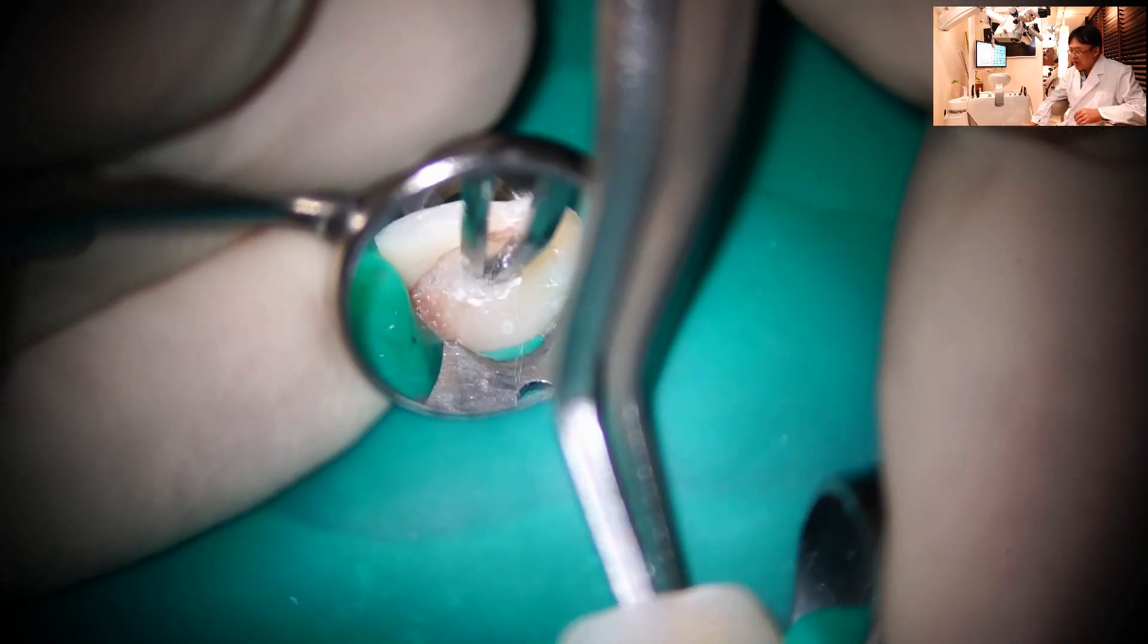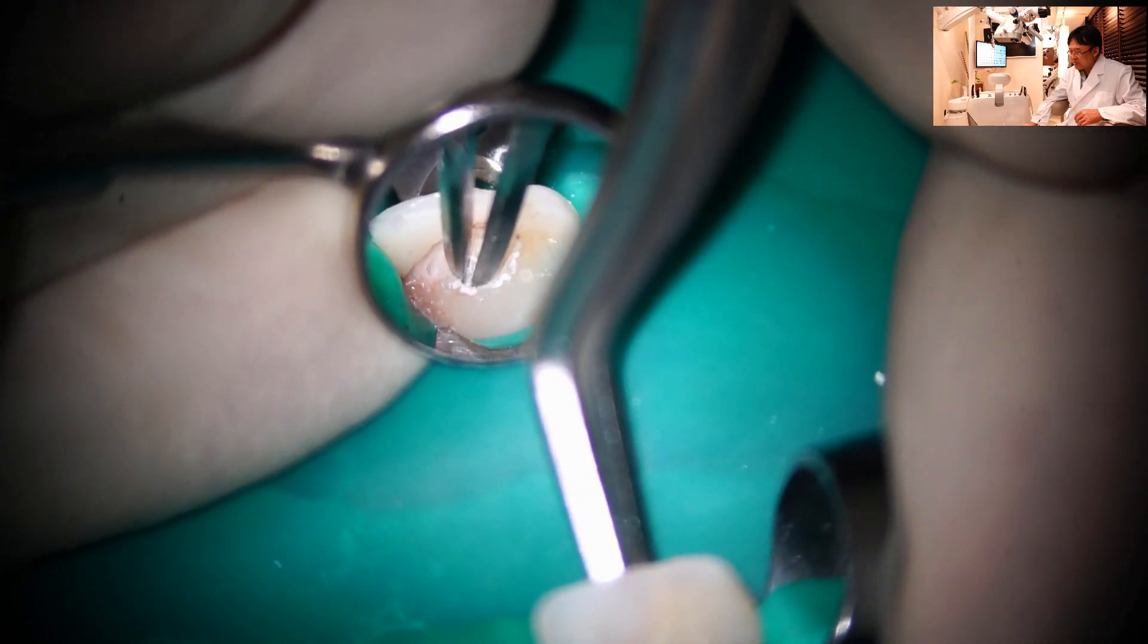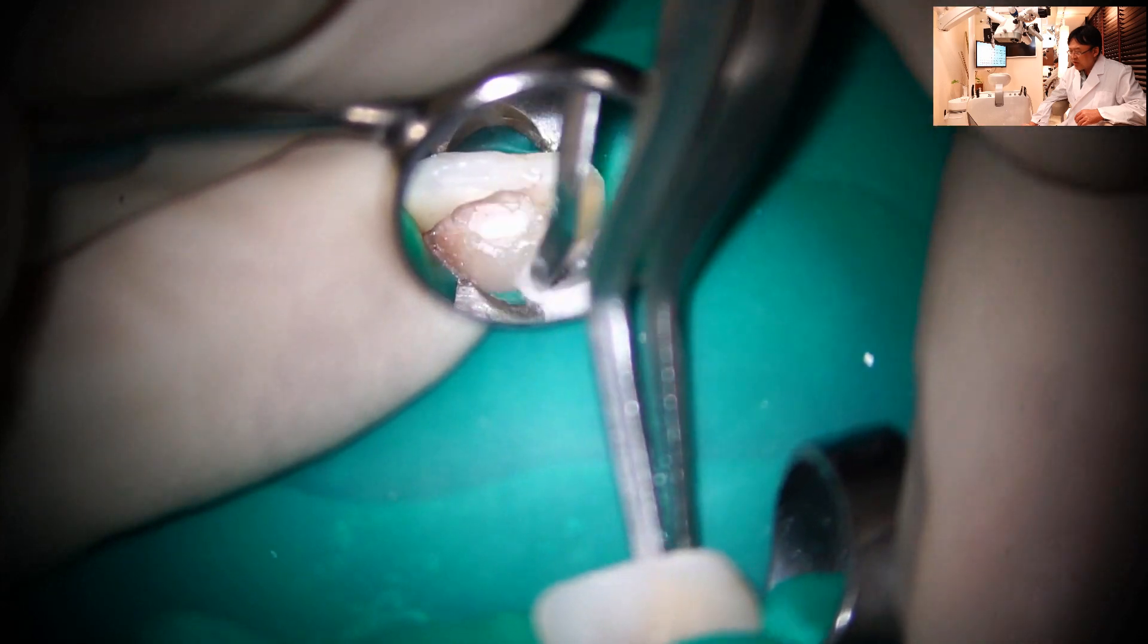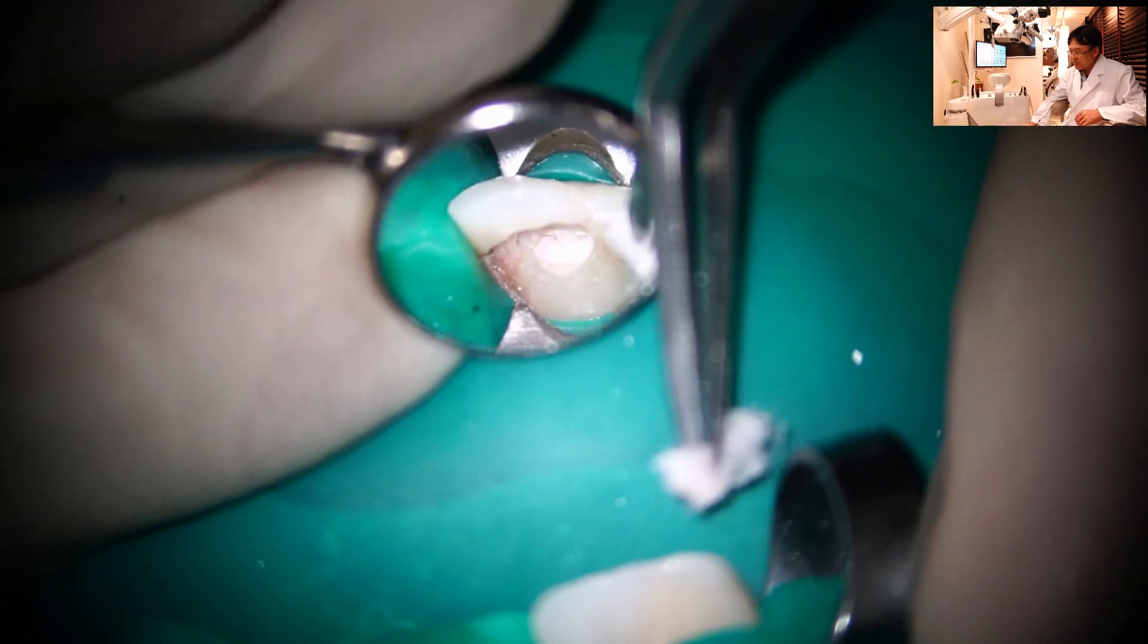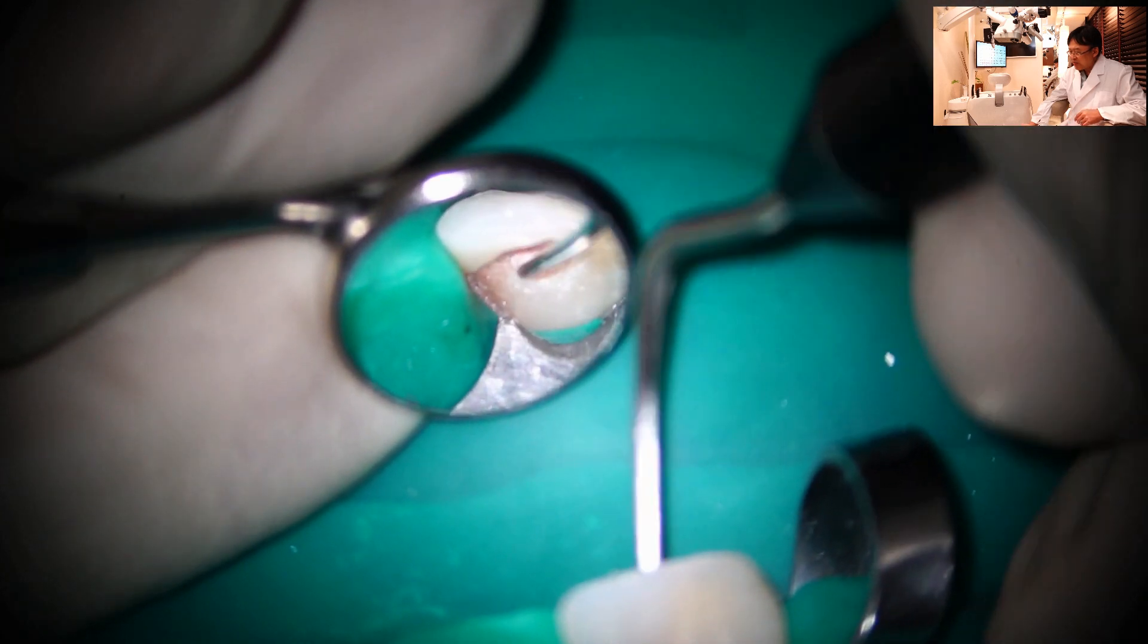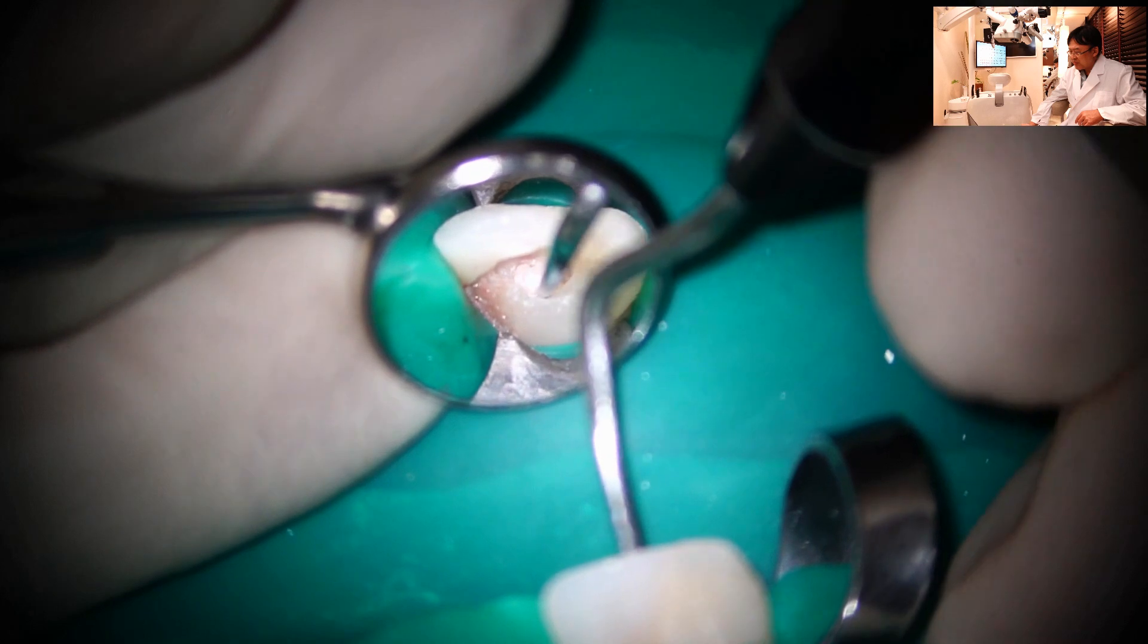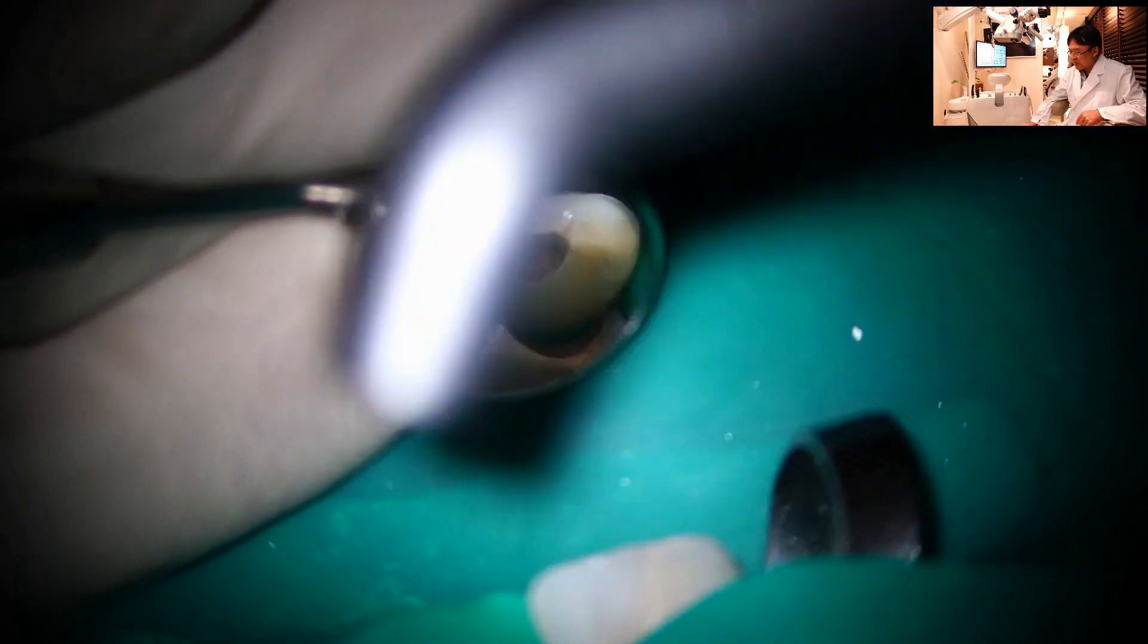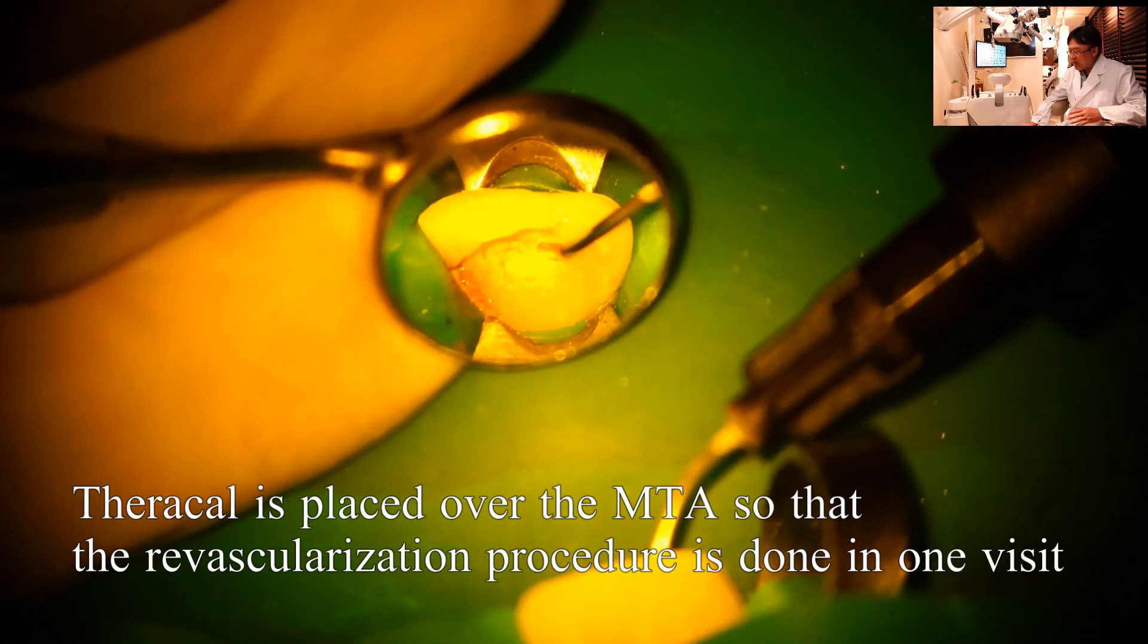Now I can see enough MTA over the blood clot. I'm removing excess MTA. And I need to dry it, then I'm placing Teracal over the MTA, so I can do this in one visit.